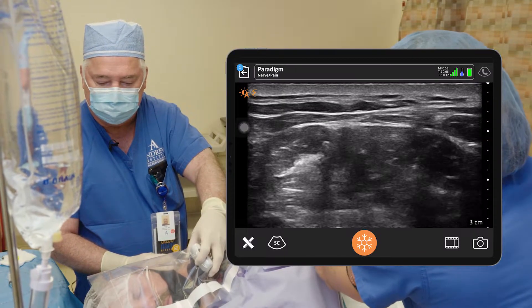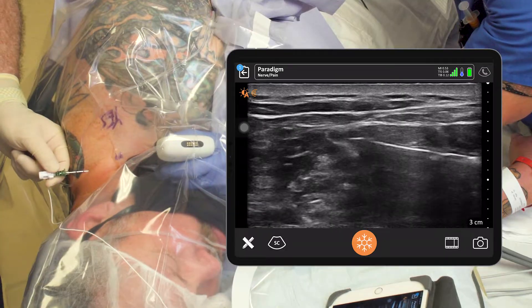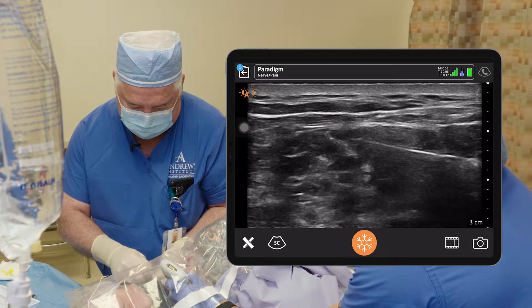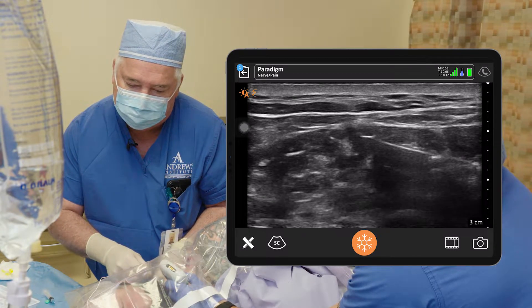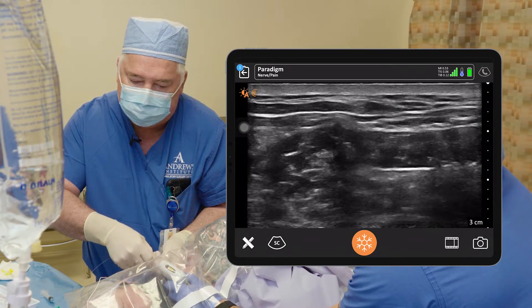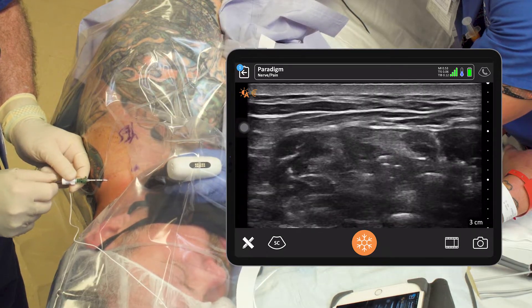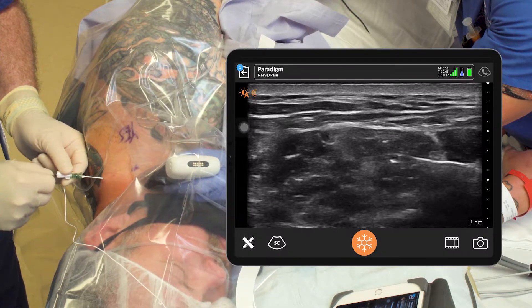We're going to stop right there. I'm going to let Rocky take my probe. We're getting a little twitch, so we got a little closer to the nerves. Now we're going to slide our catheter in this space just to the right of the stoplight. See the needle? See the catheter come out right there? I'm going to lay the catheter down and then bring it back up. Threading the catheter just between the brachial plexus, the interscalene stoplight, and the middle scalene muscle.